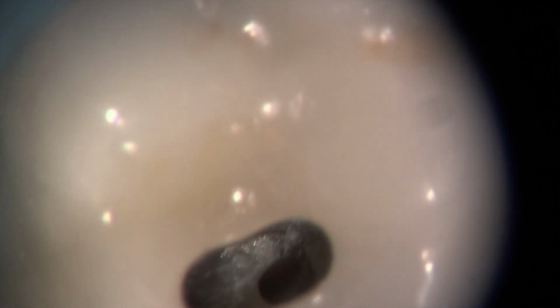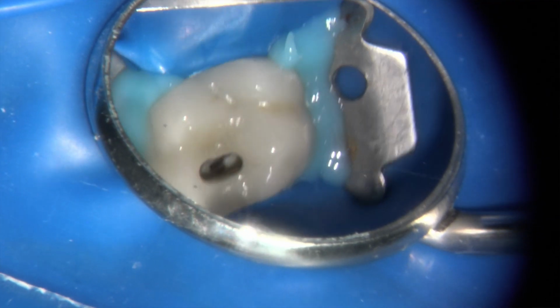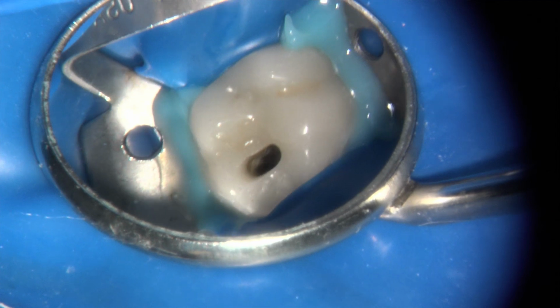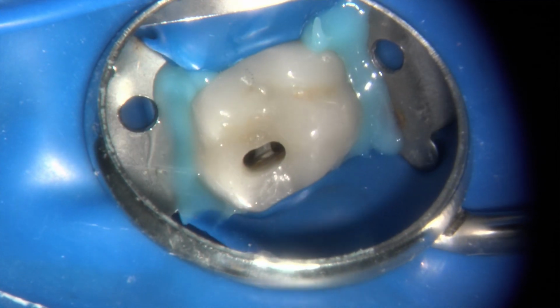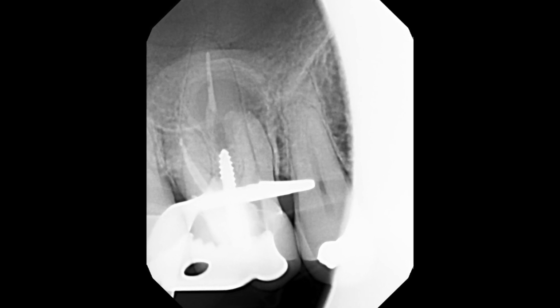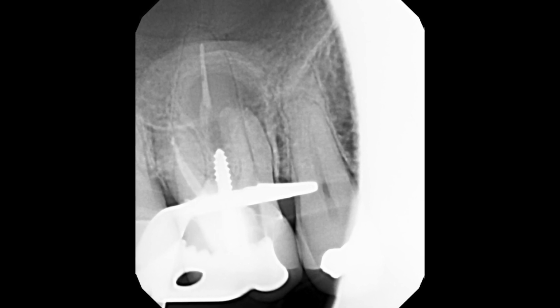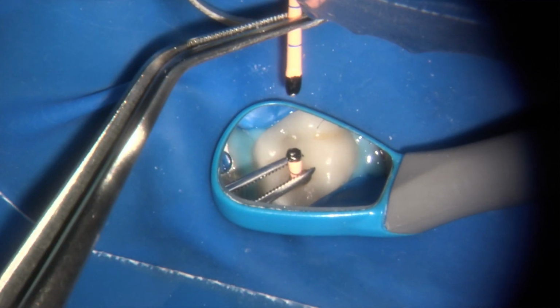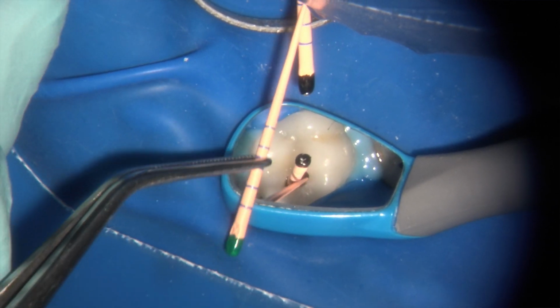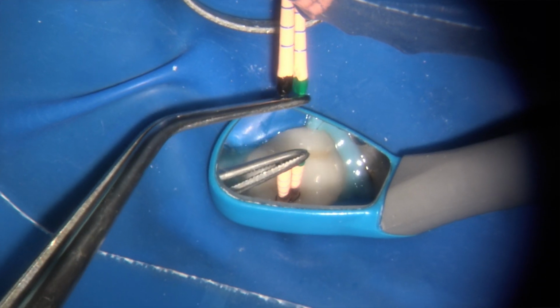And you can see that what the TRITON does during your irrigation process, it leaves this nice chalky and clean surface area inside your chamber as a result of your irrigation process. So we've done our irrigation, and now, as you can see here from the x-ray, I just take an x-ray to make sure we've removed all of the gutta percha debris, and all the gutta percha debris has been removed. Now we're going to fit in a size 4004 cone in the mesiobuccal on the MB1 and a size 3504 in the MB2.